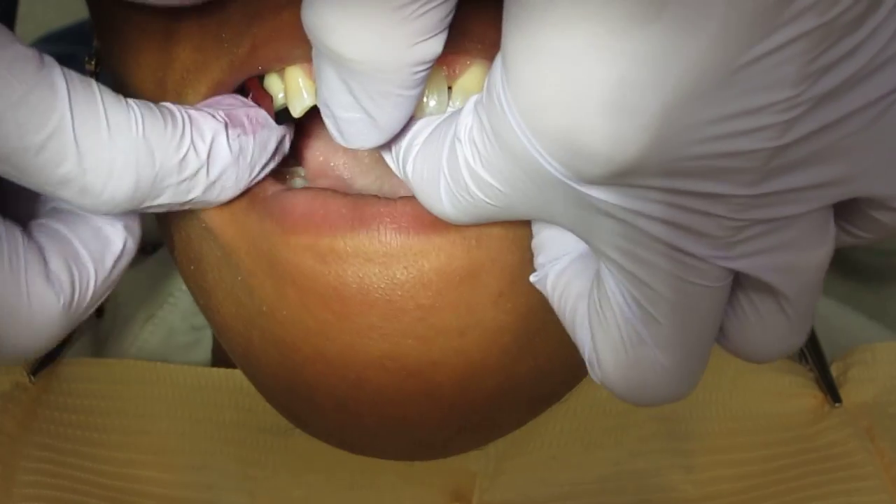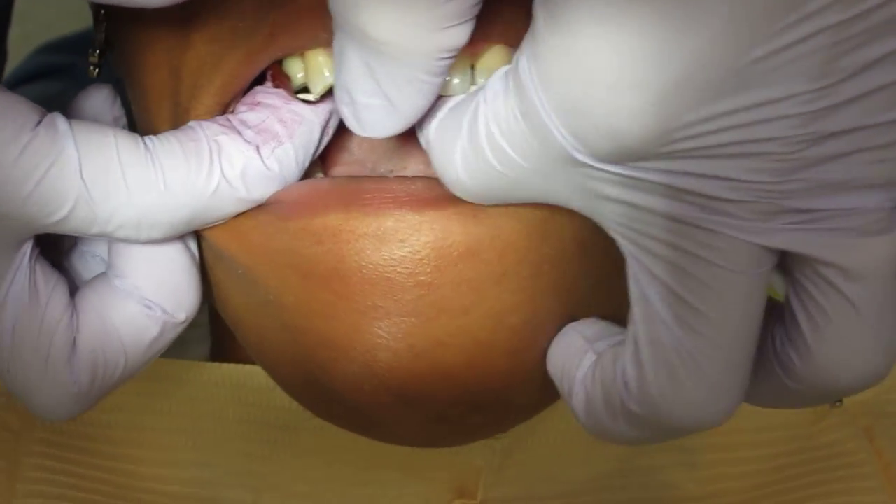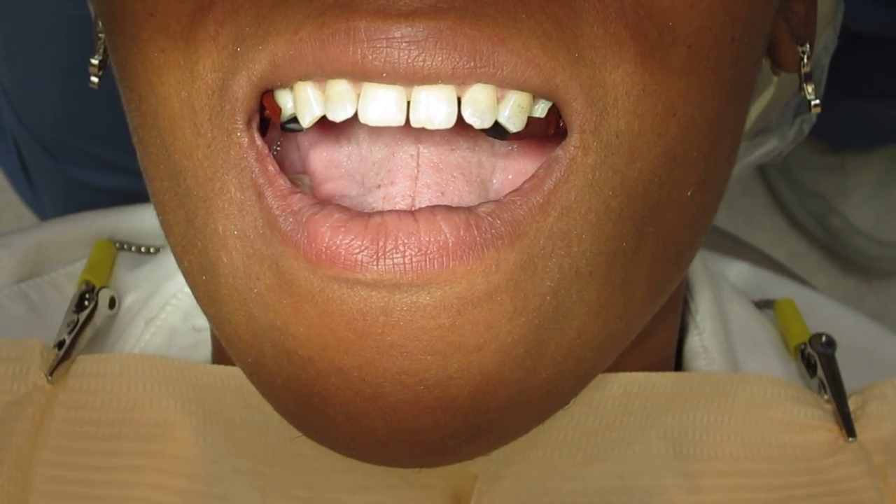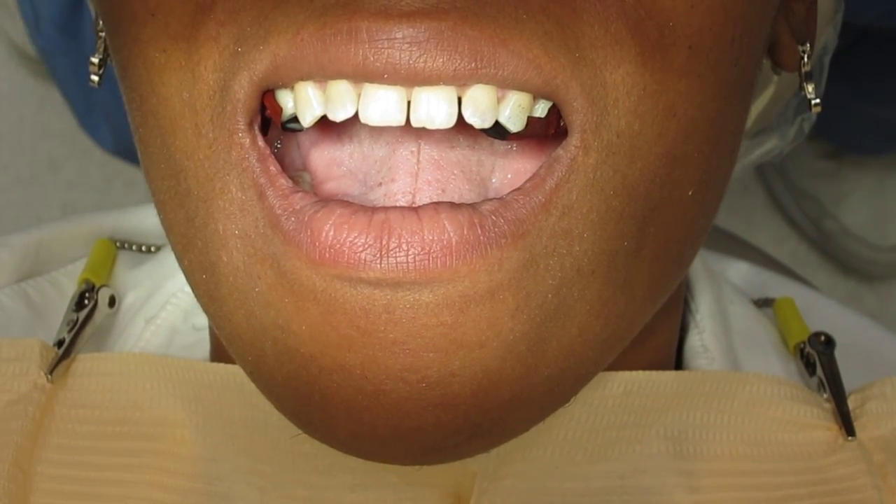So I've made adjustments already, and I'm actually fairly happy with the way this is seating. And let's take a look at what we're looking for.